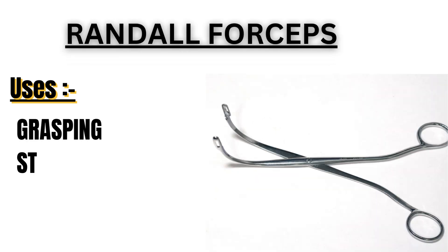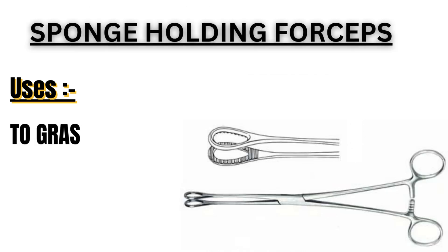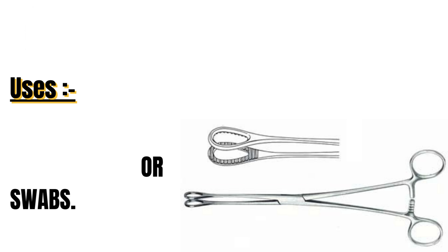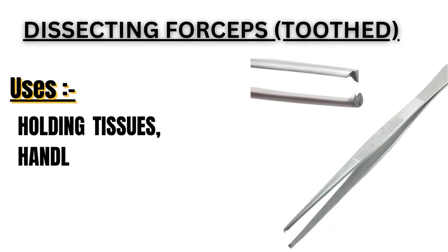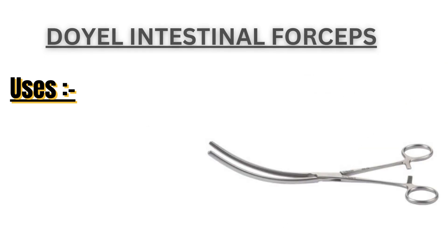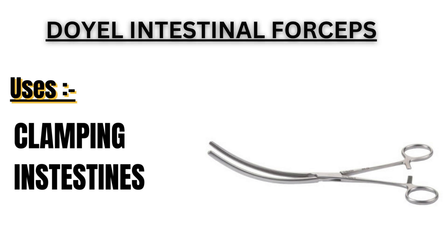Randall Forceps: it is used for grasping stones or polyps. Sponge Holding Forceps: it is used to grasp and hold sponges or swabs. Dissecting Forceps Toothed: it is used for holding tissues and handling sterile dressings. Doyle Intestinal Forceps: it is used for clamping intestines.